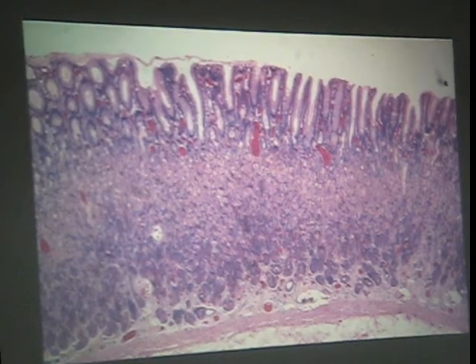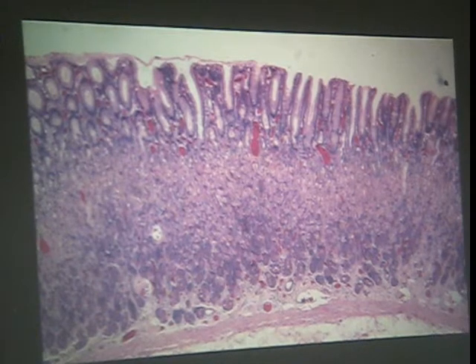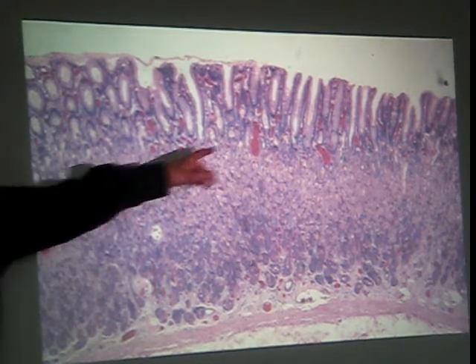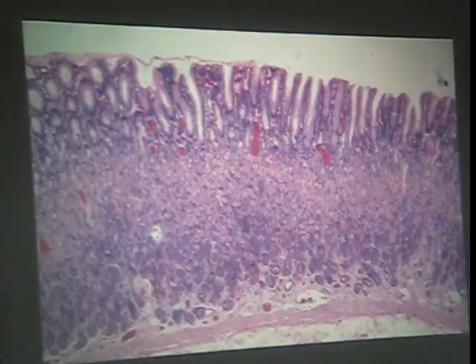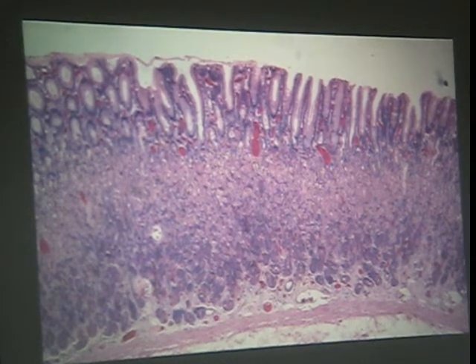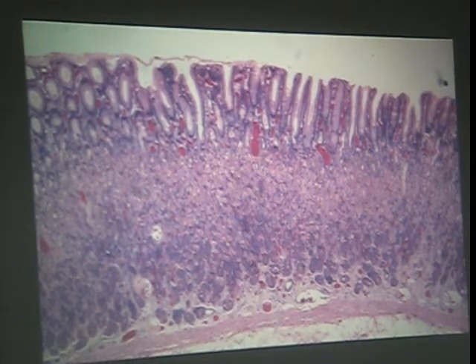And up here you've got kind of a funky mixture, because you've got surface mucus cells, which are columnar cells. The apical two-thirds of the cell is producing mucus, which doesn't stain very well. And their nuclei, which do stain, are at the bottom of the cell. All right? So again, this is something you can see just by looking by eye. That tricoloration, if you get that, you've got to start thinking stomach, and in particular the fundic or corpus region.